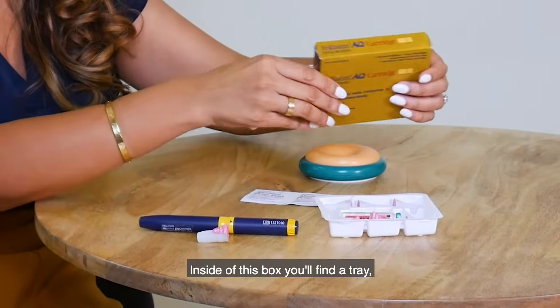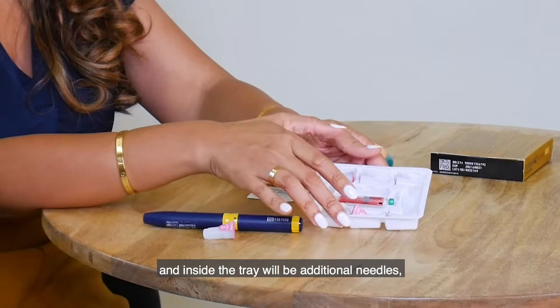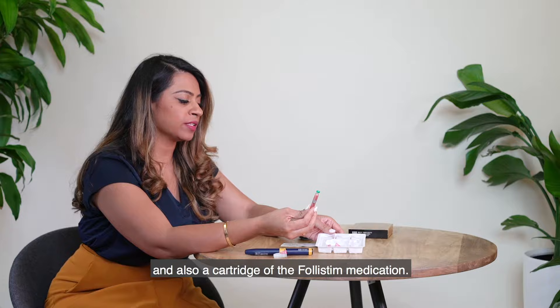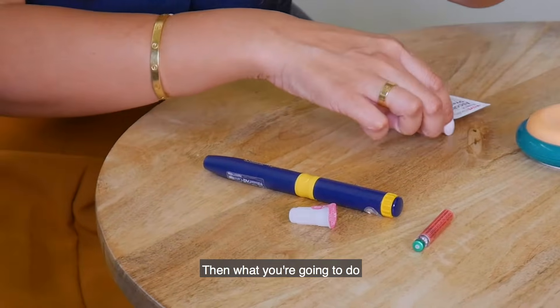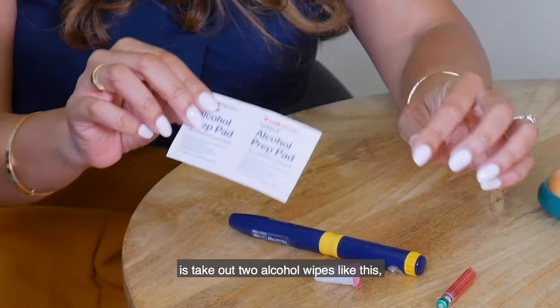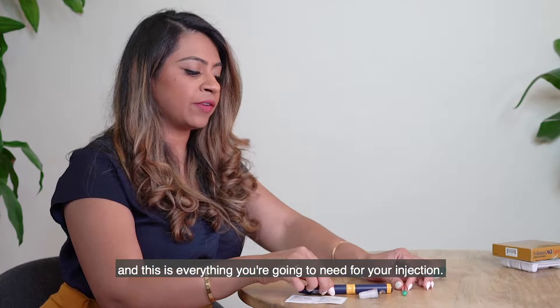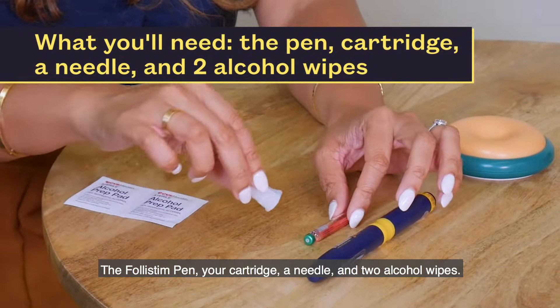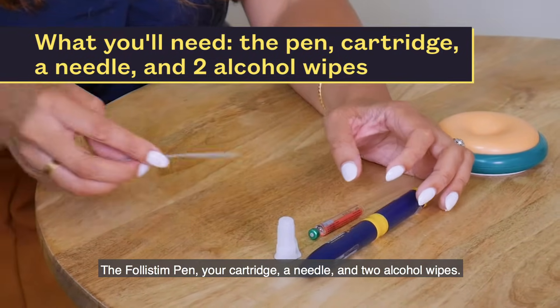Inside the box you'll find a tray, and inside the tray will be additional needles and a cartridge of the Follistim medication. Then take out two alcohol wipes. That's everything you're going to need: your Follistim pen, your cartridge, a needle, and two alcohol wipes.